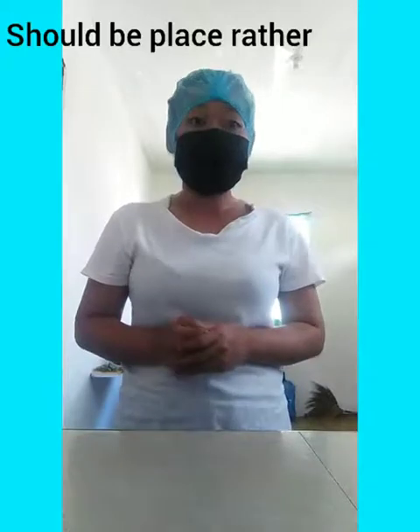Soiled surgical attire should be placed in designated containers after use. Home laundering is not recommended because of the potential of contamination from the healthcare facility to the home. Unscrubbed personnel should wear button or snap long sleeve jackets to contain bacteria shedding from the arms. The surgical attire selected should completely cover other garments worn beneath them.